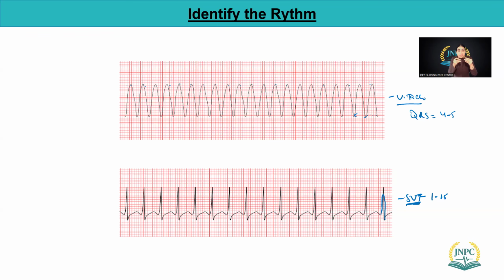Think about the ventricles not even relaxing and no blood being there. Think about cardiac output, it will be very low. So this client can have a life-threatening condition. And at that time we really have to check the pulse too, right? If pulse is present, treat in another way. If pulse is not present, do not waste time. CPR and then defibrillation. Always give CPR when the client is pulseless, right?